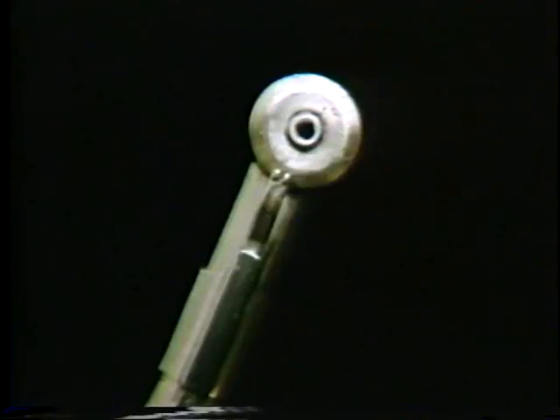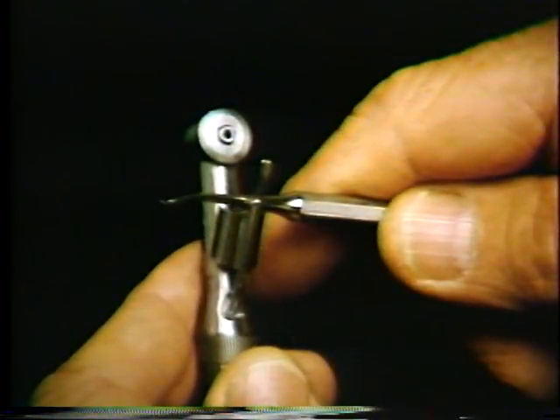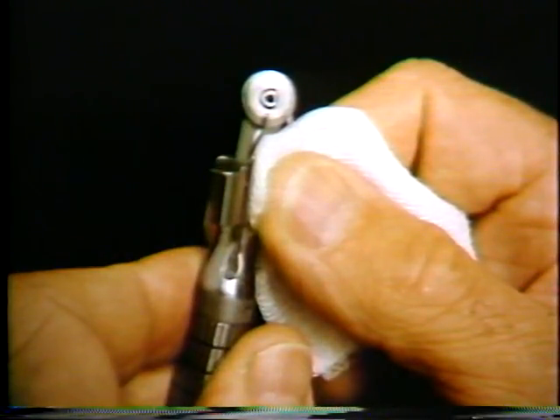It's also very important to clean under the spray clip, since debris will accumulate in this area quickly. Carefully lift the spray clip off the handpiece with a small screwdriver or a dental instrument. Don't pull the spray clip out too far because you might detach the neoprene hoses which are attached to it inside the handpiece. Then clean underneath the spray clip with a 2x2 alcohol sponge, making sure to remove all debris from inside the clip itself.